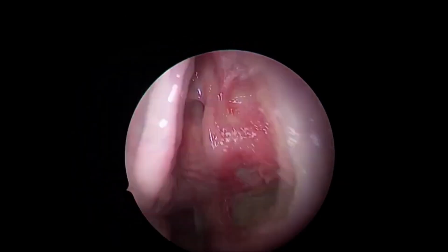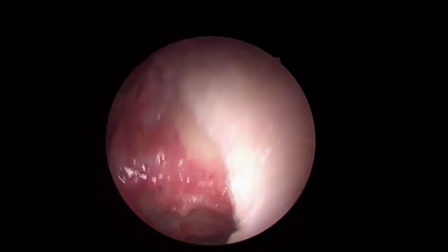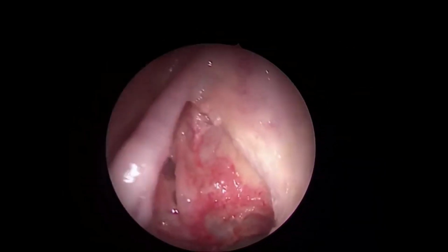Okay? Now, coming to Paramita's question, that's very relevant. How to go up and how far to go up to remove the upper part of the uncinate. I mentioned in the beginning, I have changed to the 70 degree for everyone. Is the picture good? Yes, very good. Clean the lens, I think, on the endoscope. Okay.